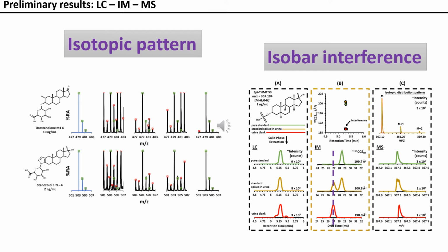The accuracy obtained in the spiked urine sample was less than 1% when compared to the pure reference material. This value is within the margin of error for drift ion mobility analysis. The high accuracy reached in this case showed also that urine matrix didn't affect the CCS measurement. Thus, excretion urine samples could be used as a surrogate for CCS measurement when reference materials are not available.